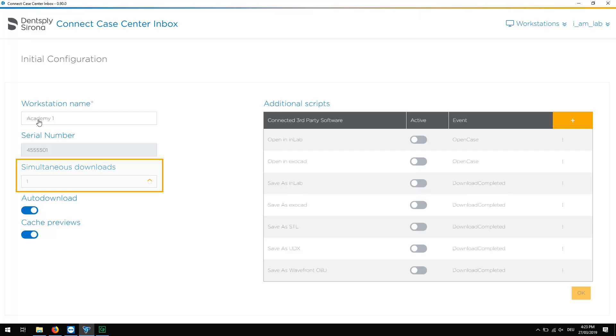Directly underneath, you can define how many incoming cases should be downloaded simultaneously. You can select between 1 and 10 downloads. Select a number that is suitable for your download speed.